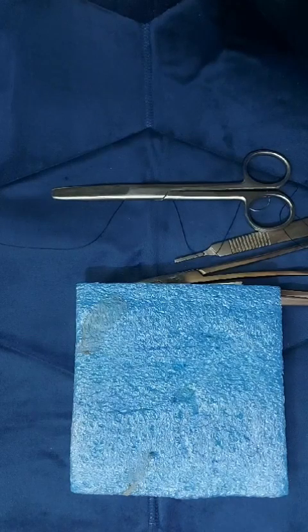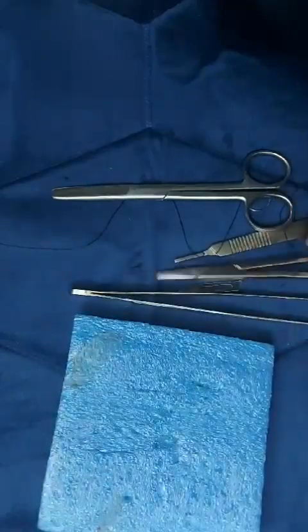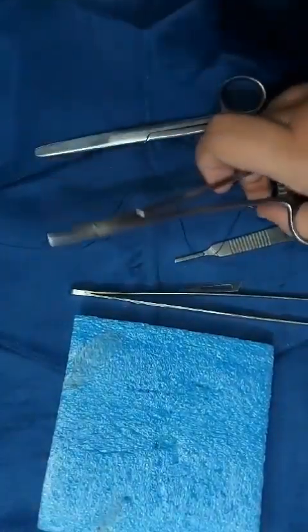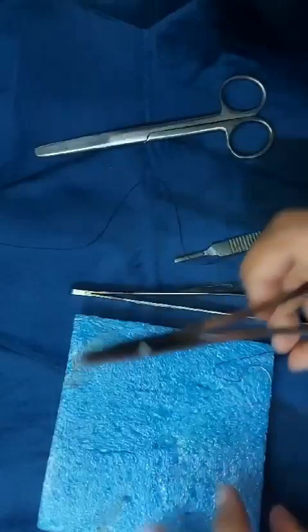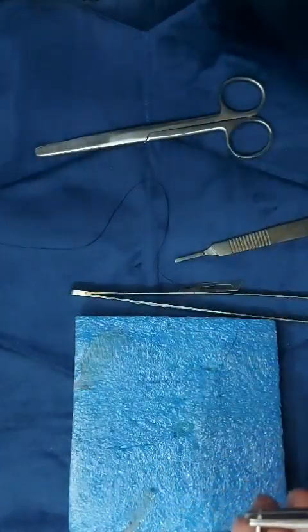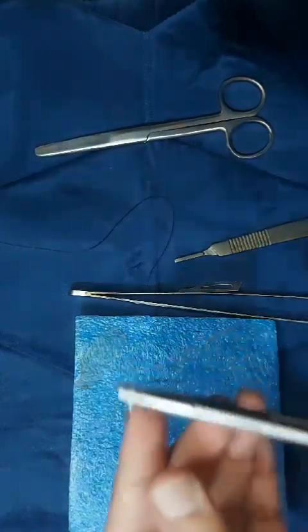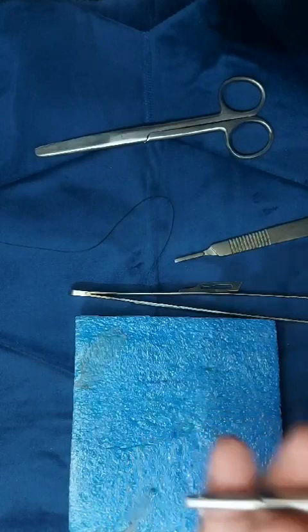First of all, I'm going to demonstrate the step-by-step technique of applying a simple suture and then tying a knot. The things I'm going to need are forceps, needle holder, scissor and a suture. First of all, apply the needle to the needle holder, 1/2 to 3/4 of the distance from the tip of the needle.